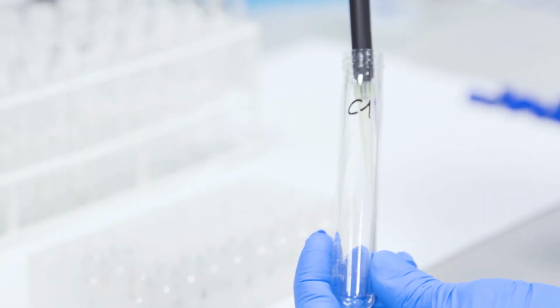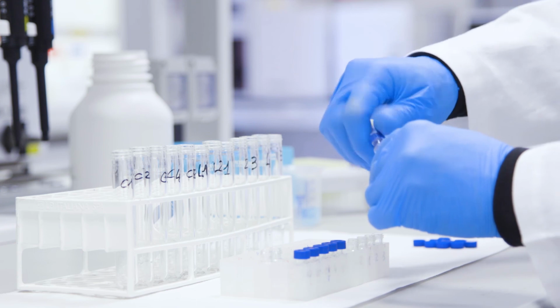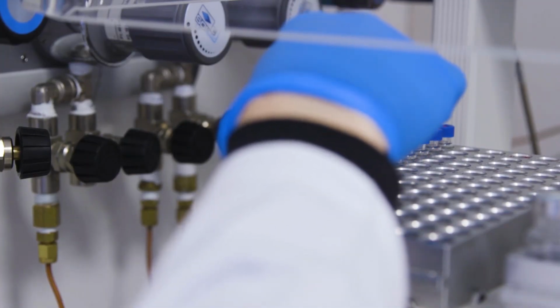After 5 minutes, we return to the preparative phase, where the tubes are cooling at room temperature. After that, we transfer all the samples into vials with reduced volume for the autosampler. We place the vials on the tray of the autosampler and start the acquisition sequence.